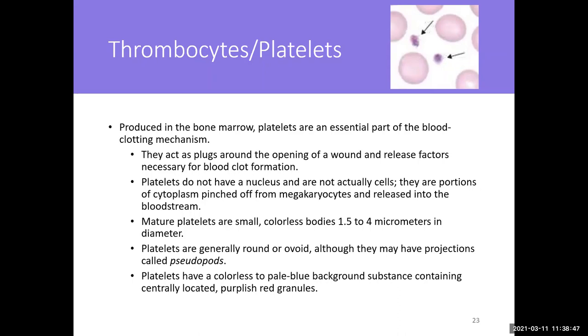They're colorless to pale blue to purple, just depending on how your stain is. But you can see those here in this image. And when you're looking at them on the slide, sometimes they look like somebody's just stained some cotton or something and thrown it against the slide.